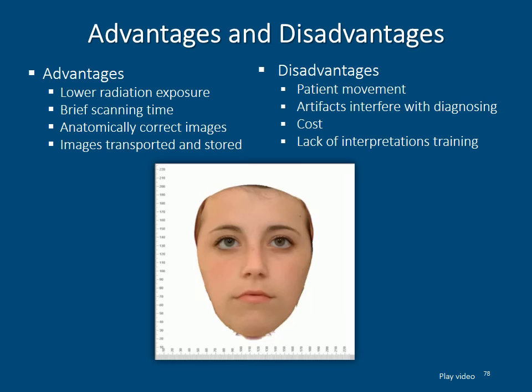There are advantages and disadvantages to cone beam as well as any other radiographic exposure technique. The advantages are that it uses a lower radiation exposure setting, and the scan is done in a very brief time frame.